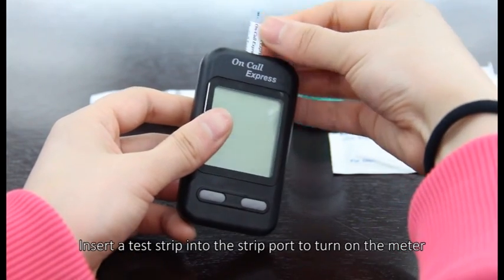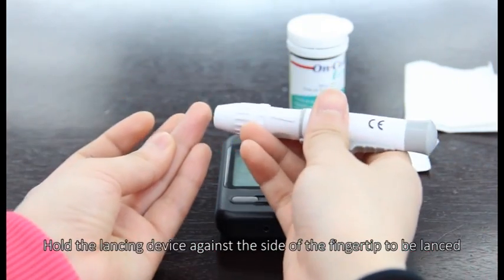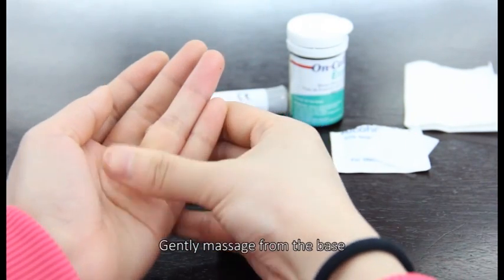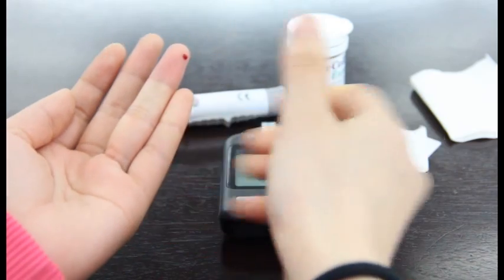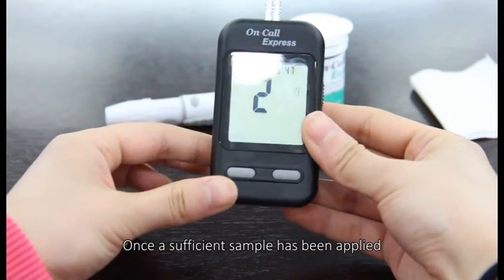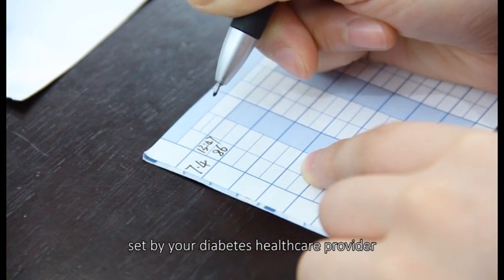Insert a test strip into the strip port to turn on the meter. Check the display — the meter is ready for testing only when the blinking test strip and blood drop symbol appears. Hold the lancing device against the side of the fingertip to be lanced. Record valid results in your logbook with the date and time and compare them to the target goals set by your diabetes healthcare provider.